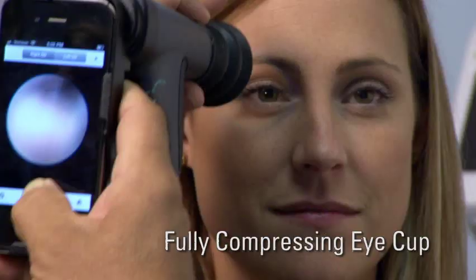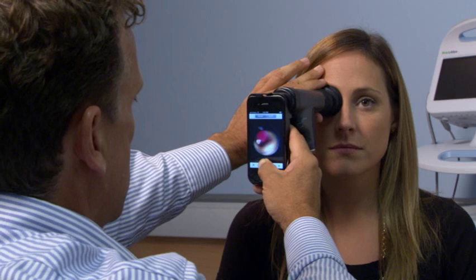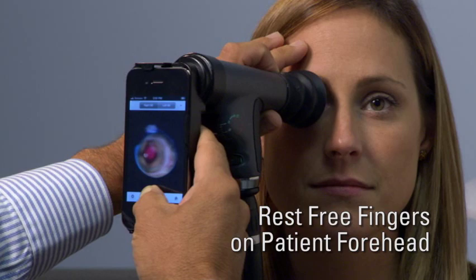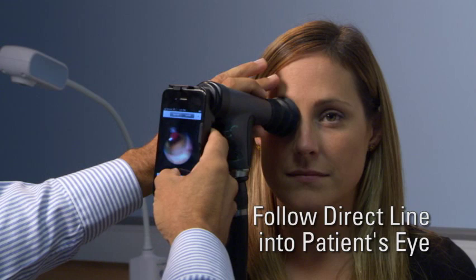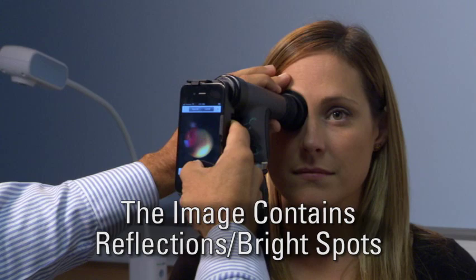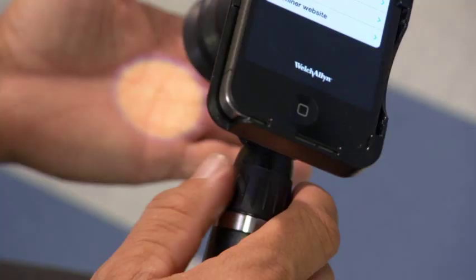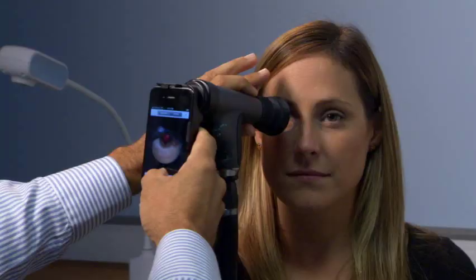Be sure the iExaminer adapter is pushed into proper position on the Panoptic and that you are fully compressing the eye cup over the patient's eye. If the image of the fundus is fleeting and you can't seem to hold it for more than a split second, practice holding the scope as steady as possible and rest your three free fingers on the forehead of the patient for stability. Make sure you follow a direct line into the patient's eye, maintaining the same plane, like a train on a track. If the image contains reflections or bright spots, dim the lights and avoid being near windows. Ideally, the patient should be looking into a darkened area. Turn down the rheostat on the handle.